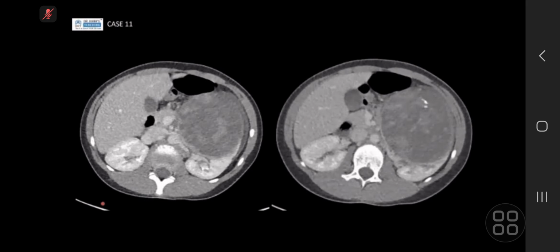Okay, so that's the kidney. What do you think of this appearance here? The parenchyma. I think that looks like a claw sign, yeah. So do you think this is still coming from the tail of the pancreas? No. I would like to retract the statement that it is coming from the pancreas. Mostly suprarenal. If it is renal, it can be a Wilms tumor, though less likely. A neuroblastoma may be my top differential diagnosis in this case.